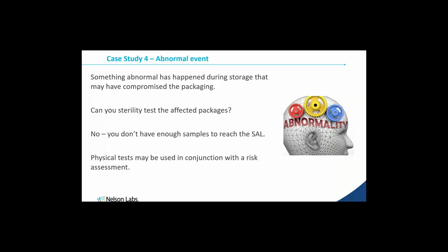And at the end of the day, we can consider sterility, we can consider packaging, we still have to consider everything else. With that temperature excursion, is my product still okay? What if I have a combination product and it's a pharmaceutical? Well, I need to assess that too. A sterility test isn't going to show that. It'll show sterility. Okay, so I have 10 samples. I've shown an SAL of 10 to the -1. Well, I still haven't shown sterility, but I also still haven't shown my product's still okay.